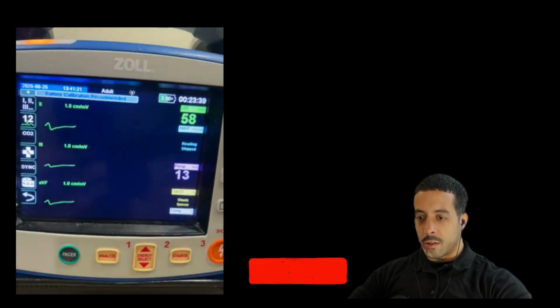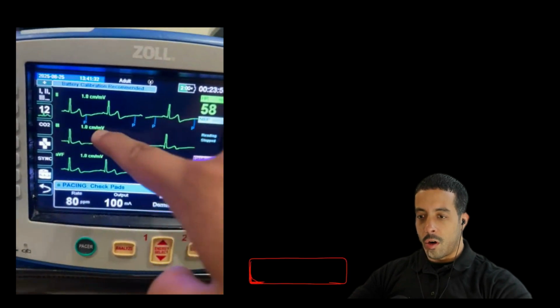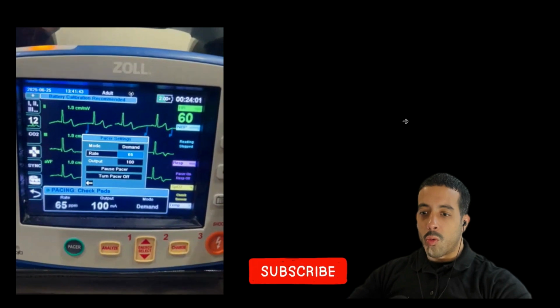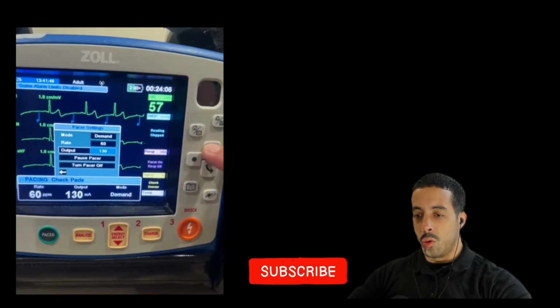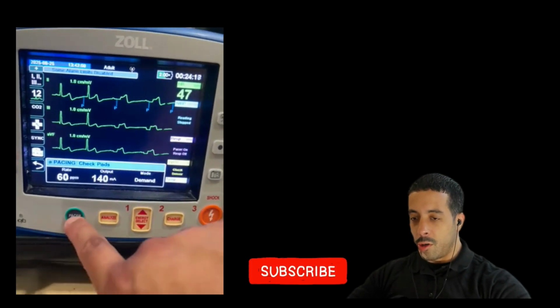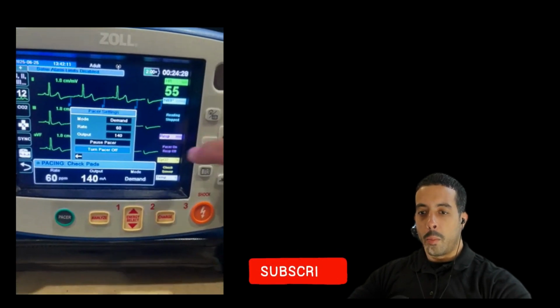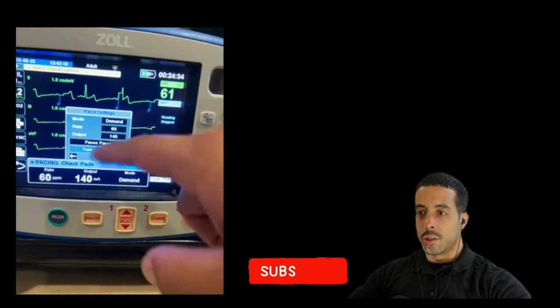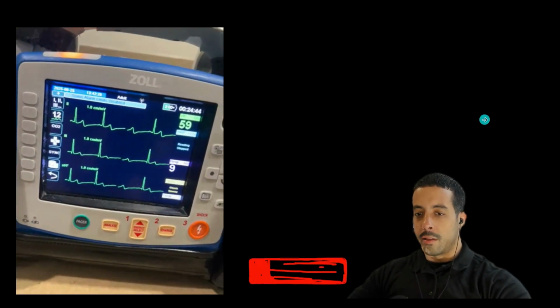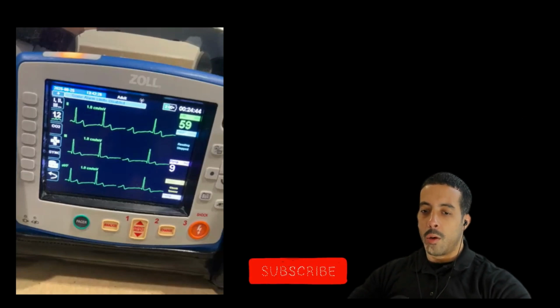When we pace patients, notice that is what is going on in the screen here. There's mechanical capture and electrical capture. Remember, my people, I told you there's 2 action potentials. With the transcutaneous pacing, what we're doing is trying to synchronize them through a demand pacemaker. And this is actual footage obtained. If you look at the dates right here, you'll see this is a medic partner of mine who I requested make a quick video of them playing with the pacer.